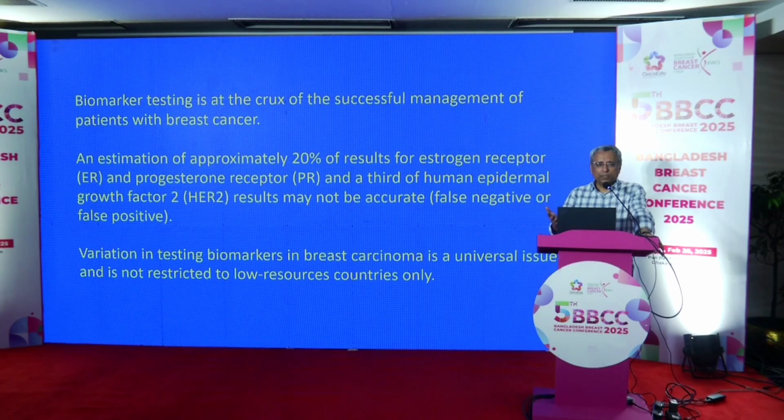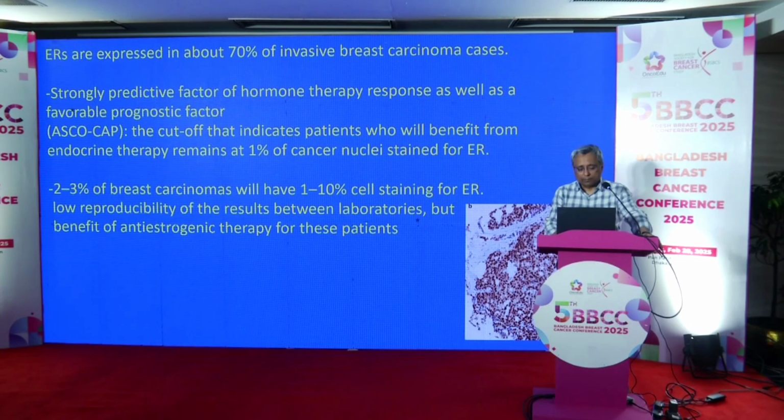Although it might seem like ER, PR, HER2 is a staple immunostain, there are a lot of labs, even in Dhaka, that do only ER, PR, HER2. They don't do any other assays, only ER, PR, HER2, because of the large number of breast biopsies. So it's quite critical that we pay attention to all the steps of doing immunohistochemistry, especially for these predictive biomarkers.